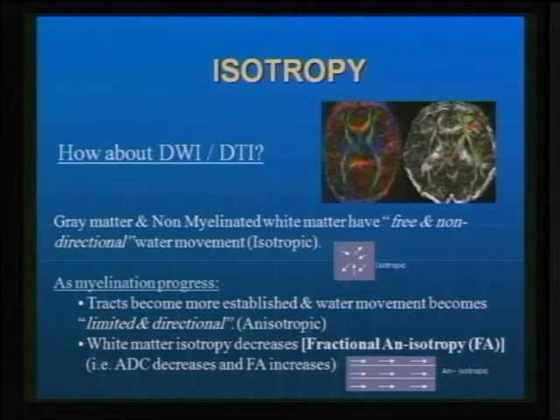Basically, this is the basics of understanding normal myelination pattern and progression. As I said, you don't have to memorize it. Just understand that this is an active, ongoing process. It's not one step. It's not all or none. It's a continuous process that goes through different stages at different times. Have this in mind, print it, copy it, draw it, and stick it next to your monitor if you're reading neonatal brain, and refer to it every now and then.